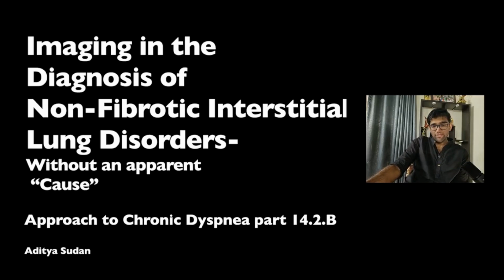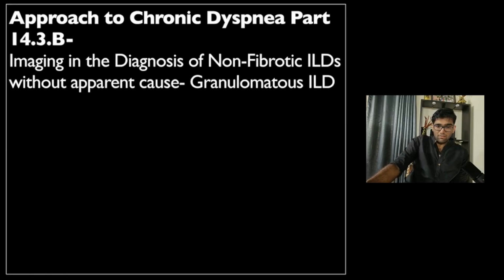Hi, so today I'll be talking about imaging in the diagnosis of non-fibrotic interstitial lung disease, and this will be without an apparent cause. So this is approach to chronic dyspnea, part 14.2b. Today I'm going to talk about granulomatous ILDs and imaging in their diagnosis.